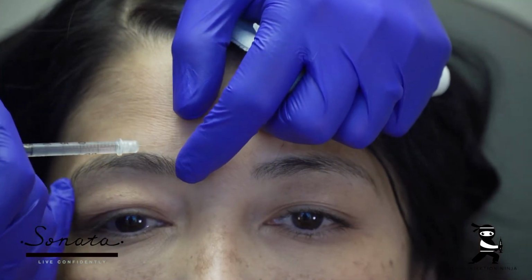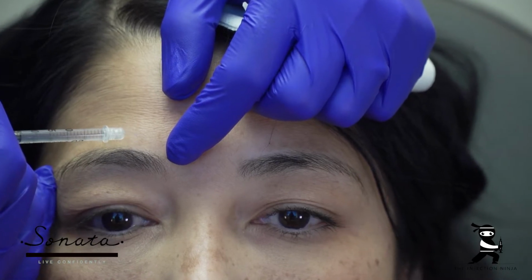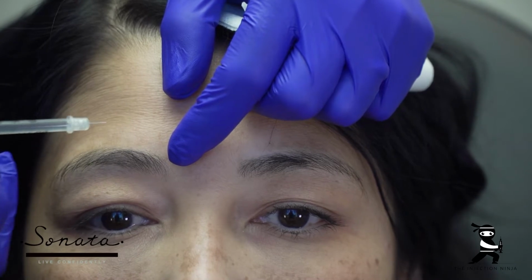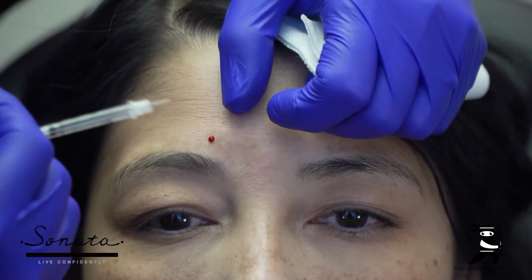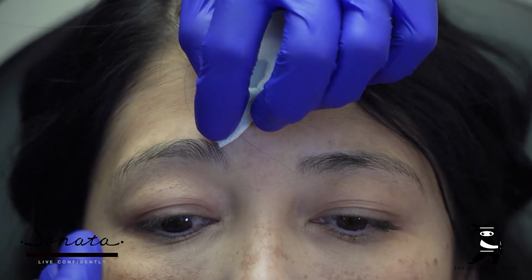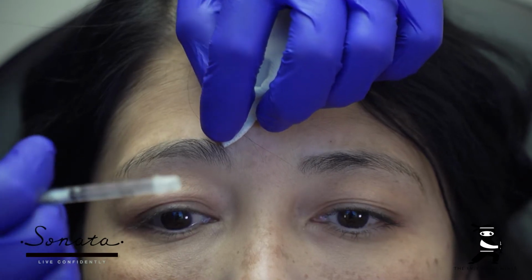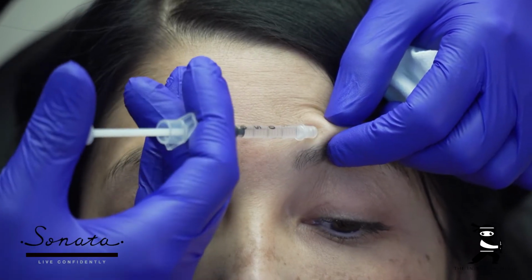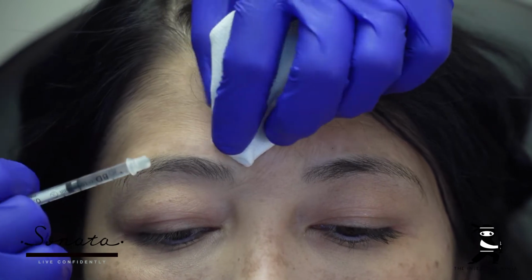Once again, we're just going to touch the needle to the skin. Patient doesn't feel much of that, just the touch, and that's your starting point. We're not starting away from the skin, we're starting at the skin. And then with just a slight flick or snap of the finger there, it's going to go in quickly. And the key is to move that needle through the dermis quickly. So once again, we'll come over here, touch the skin, and move in. And you see I'm grabbing the skin as well.